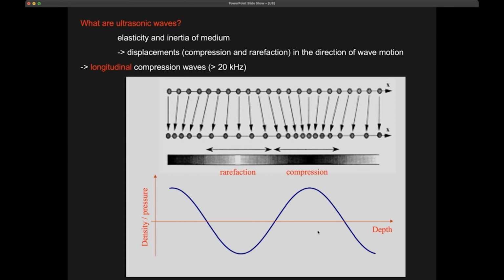So that means that when an ultrasound wave arrives, it locally compresses the tissue or the object and then relaxes it. And of course, this is related to a local pressure, a local displacement of points, and a certain velocity that is going on. And this pressure that is being used, we call the acoustic pressure. And of course, you can already imagine that acoustic pressure has to be kept within a certain limit in order to try to avoid damage. Because when you compress tissue too much, you might induce damage.